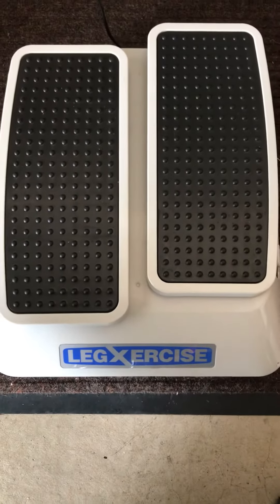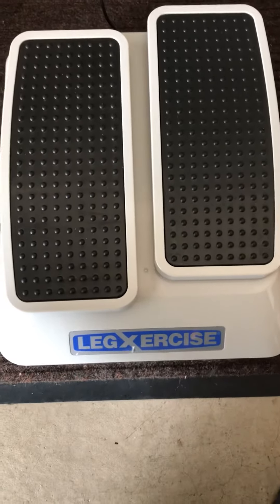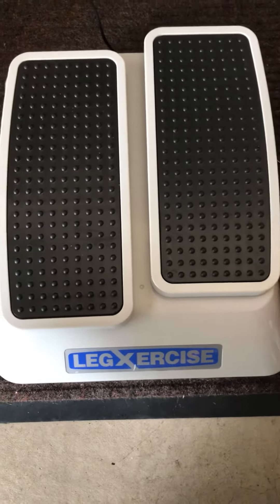Hi guys, real quick — this leg exercise machine, I just want to show you the functionality of it.